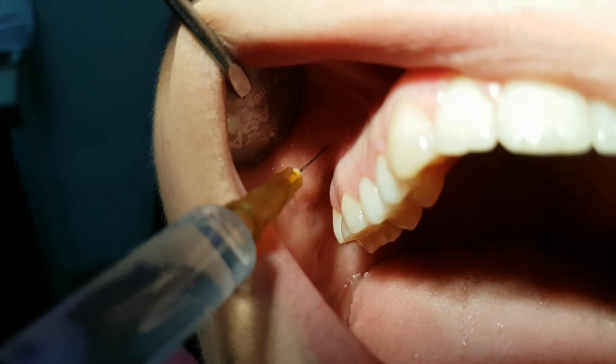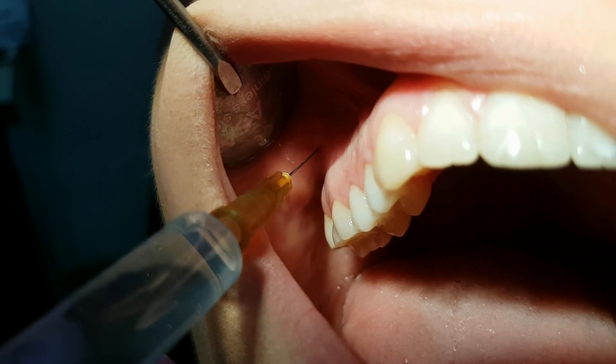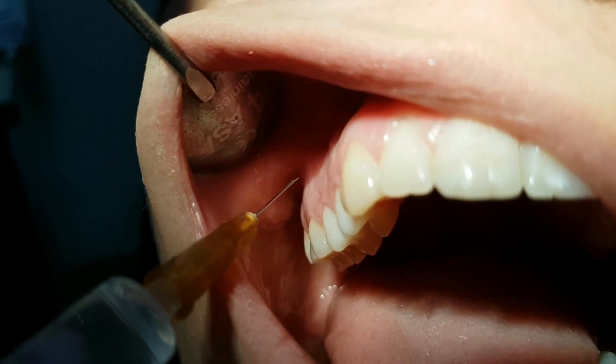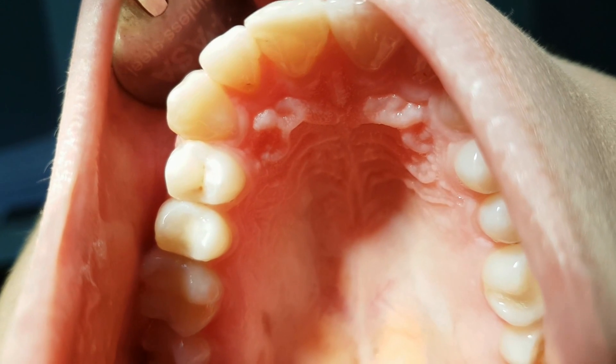We have to be careful when applying local anesthesia of this kind on the first molar. We have to avoid the Crista infrazygomatica, because this is an anatomic structure built from compact bone.